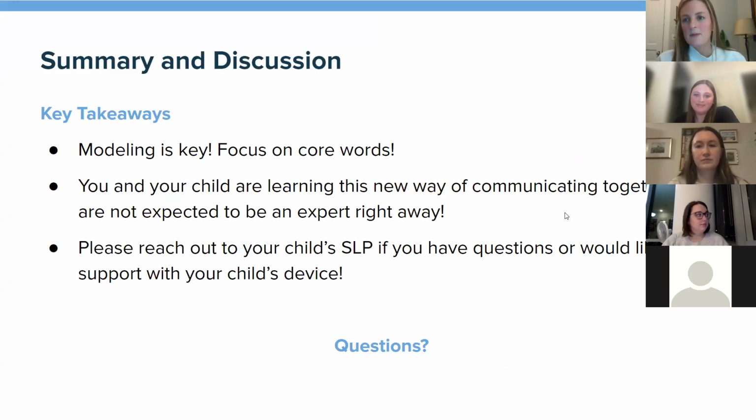Okay. I'm going to just go through some of the key takeaways, and then we'll open it up again for any questions about anything we talked about or anything that we didn't talk about. So our big takeaways from tonight, if you got anything, it's hopefully that modeling is key, and to really focus on those core words. We don't want to make it more complicated than it needs to be. Really look at those words on those first pages and try to make as many messages as you can, or even just using a couple words, like we said, want, go, just on that first page, and you can use that for many, many different situations.